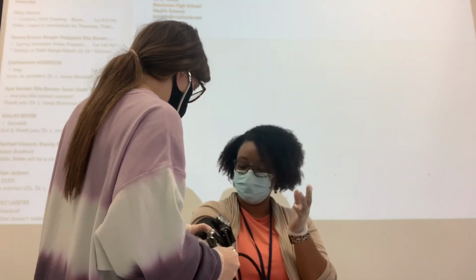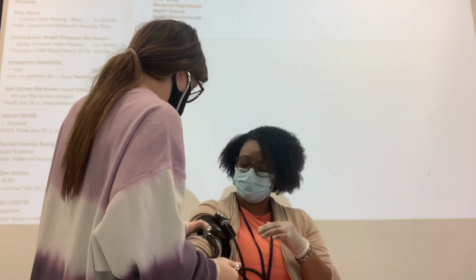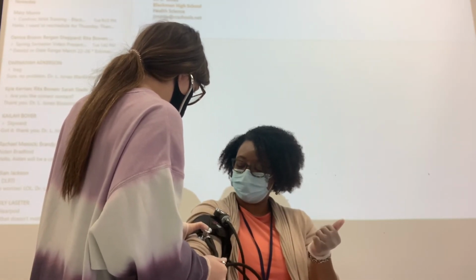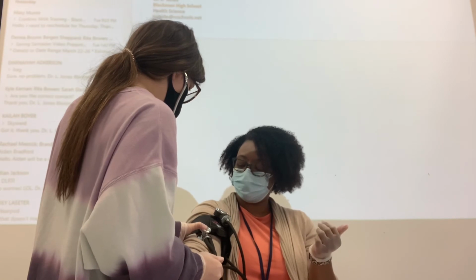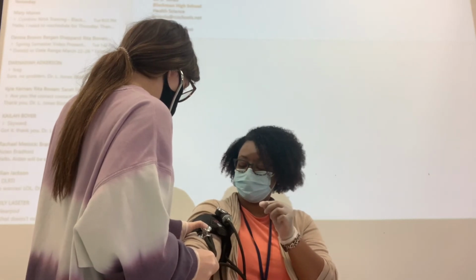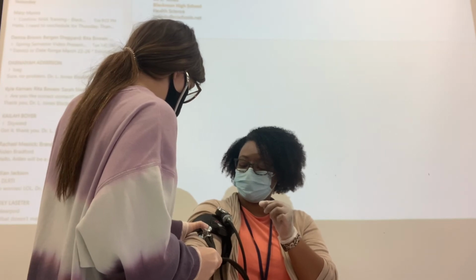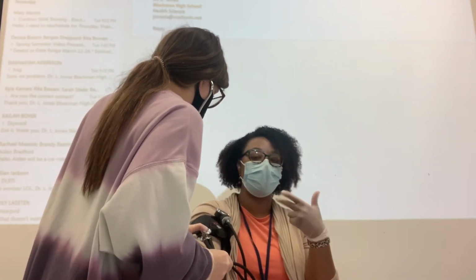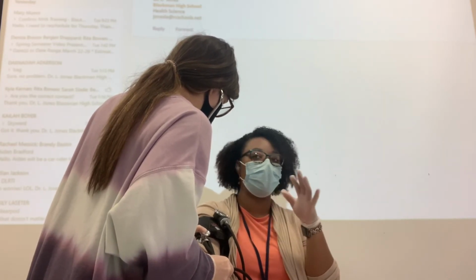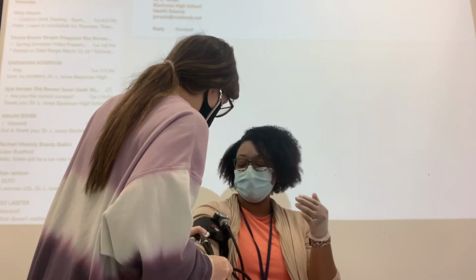140 to 160. All right, so pump it up kind of fast. All right, go up a little bit more. All right, so now she's going to slowly release. All right, and then you start hearing the first sound, which is the systolic pressure. And then she lets it go a little bit more. You keep hearing the pulse sound, and then another swishing sound at the very end, and that is our diastolic.